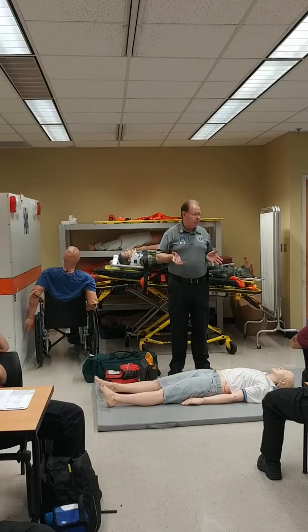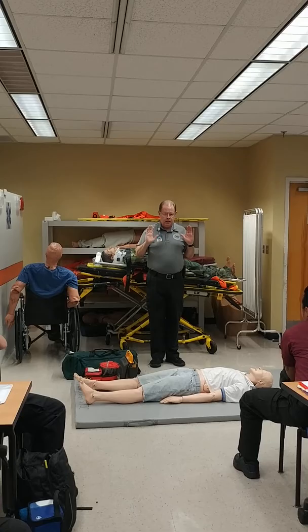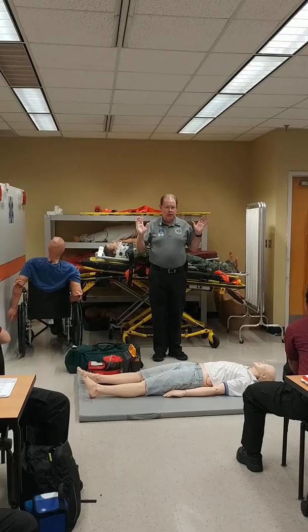As soon as we have the AED up and running, we push analyze. Everybody backs off. It's going to tell us one of two things: shock advised or no shock advised.